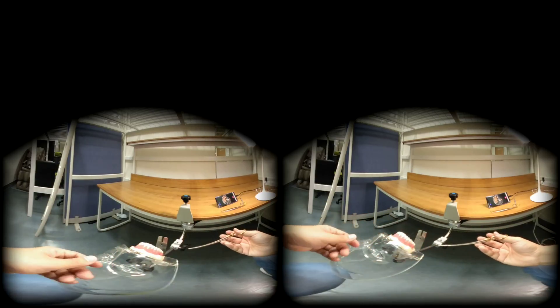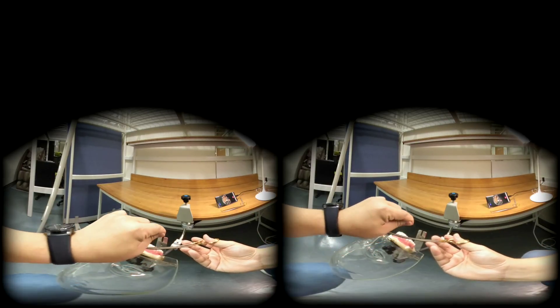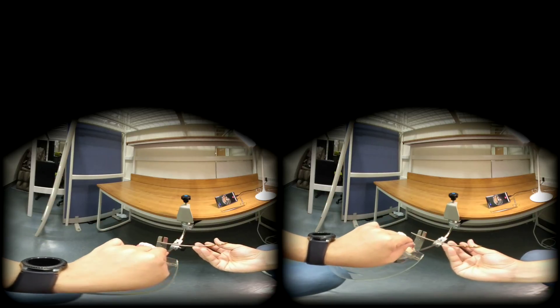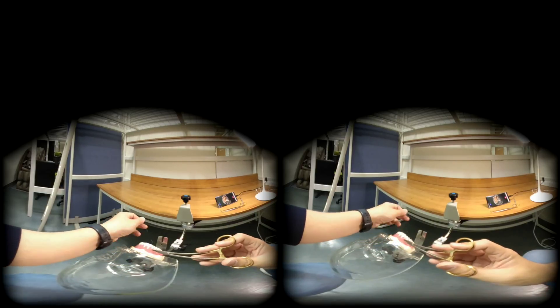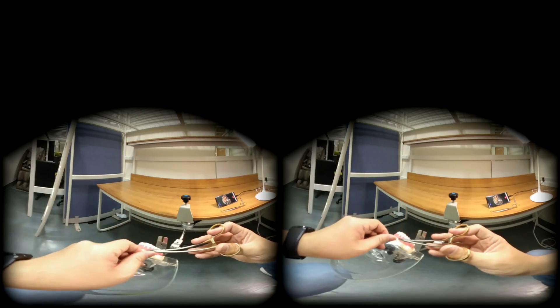Now we are ready for the second throw. Again, needle holder goes above the incision line. The silk rotates around the needle holder with the needle holder inside the loop. Grab the tip of the short end, and the short end crosses the river, and your left hand goes to the opposite direction like this. Your first throw was twice, and the second throw was once.